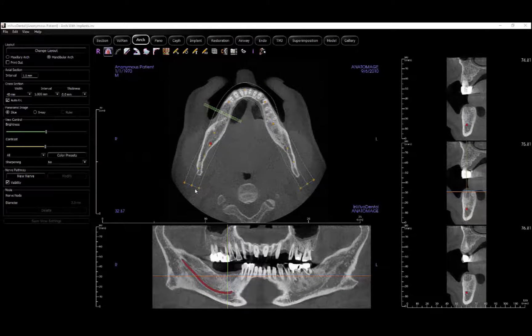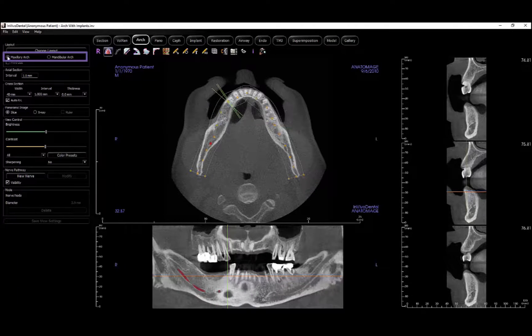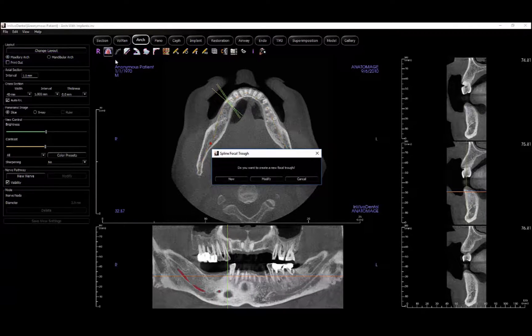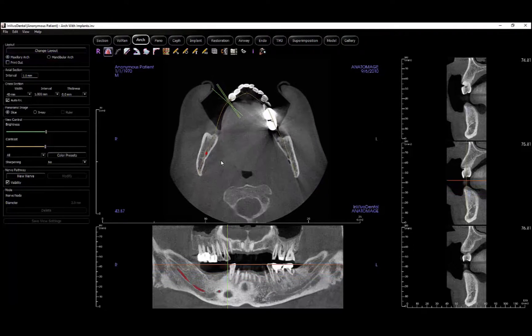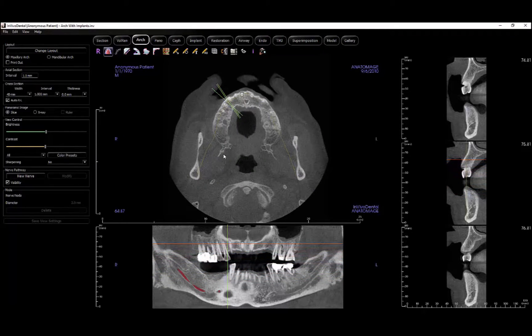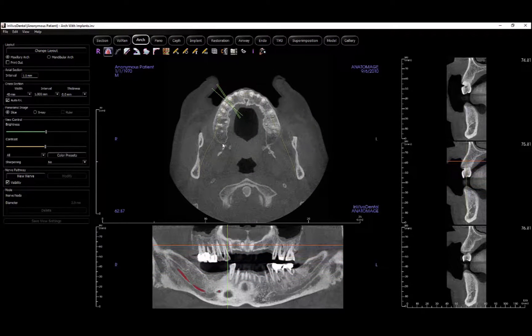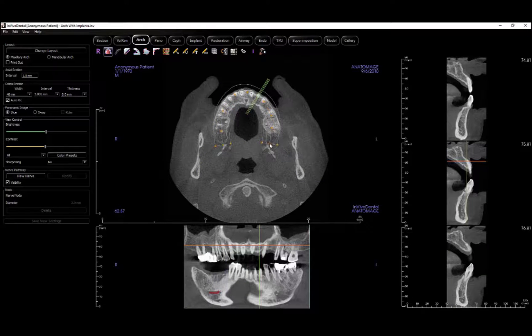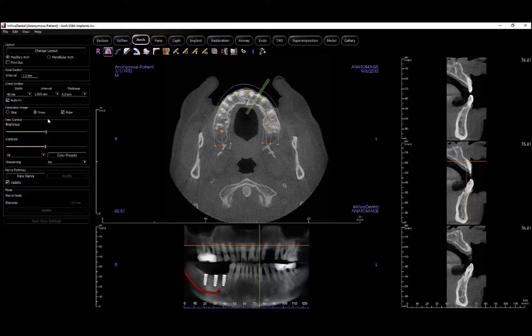If you wish to analyze both mandibular and maxillary anatomy, you can now set up two different arch spline shapes by using the maxillary arch toggle. Here, you can create a new arch spline again, this time tracing the shape of the maxillary arch. This is used to create the most accurate measurements of anatomy in each arch without having to redraw the arch spline.